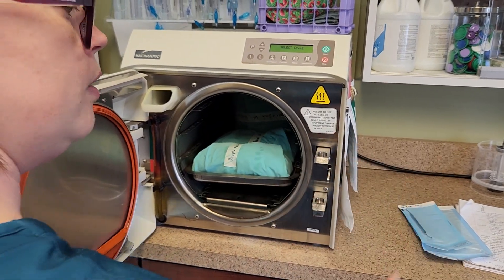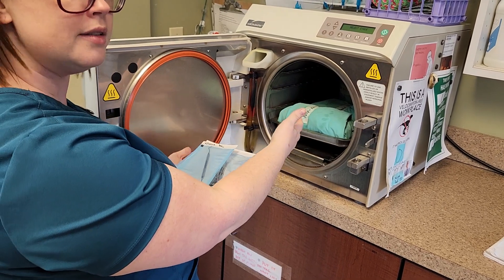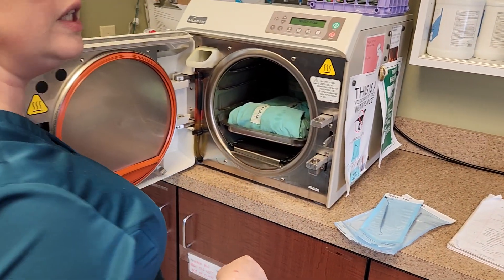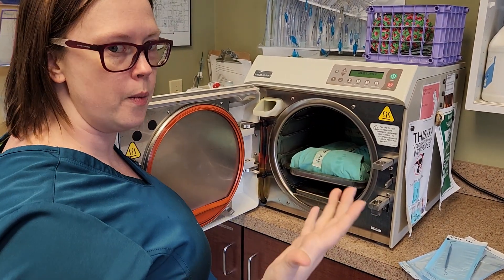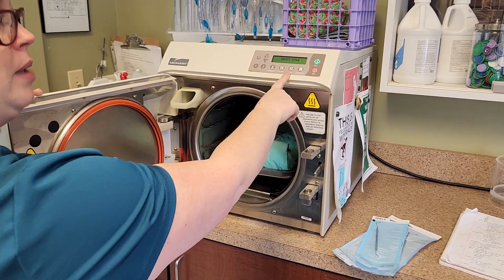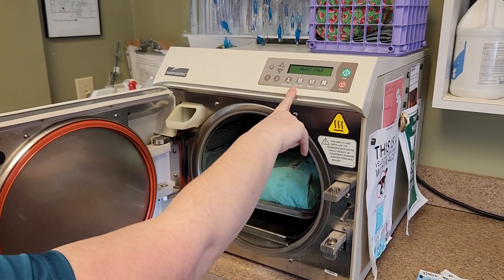You can also put pouches and packs in at the same time. If you're going to do that, you need to make sure and use the setting for the pack. So if you're doing packs and pouches, you're going to pick the pack setting. Obviously if it's just pouches, then you can just do the pouch setting.